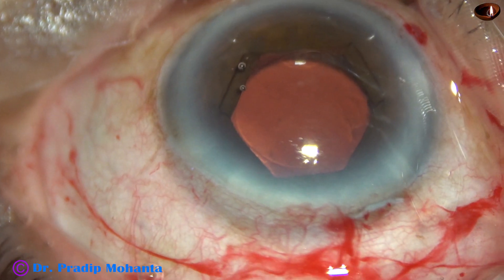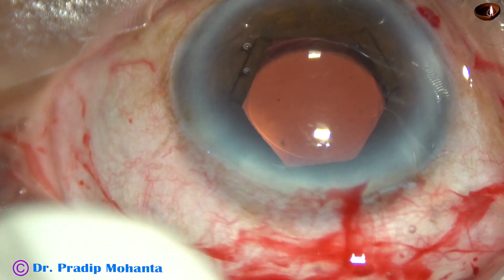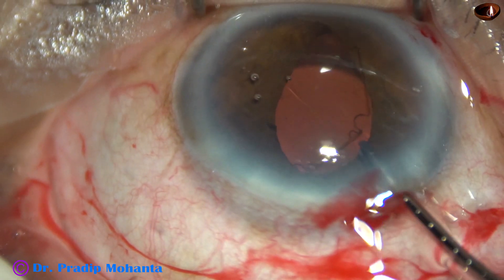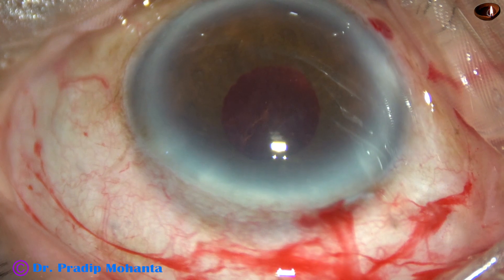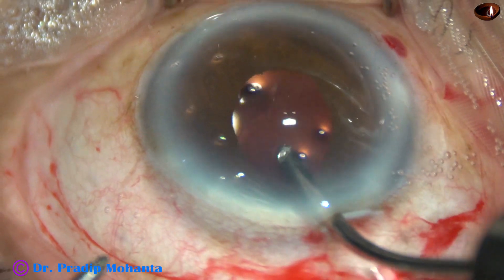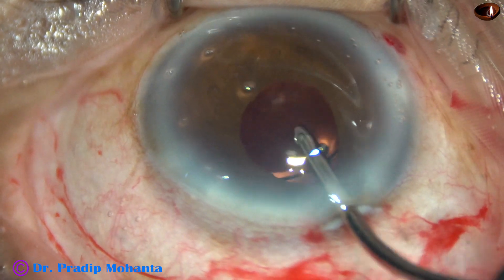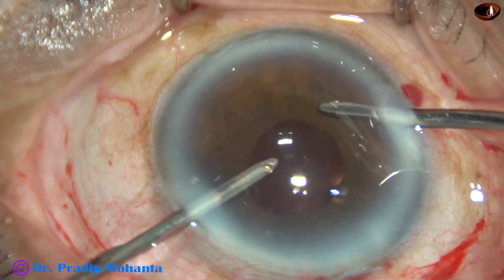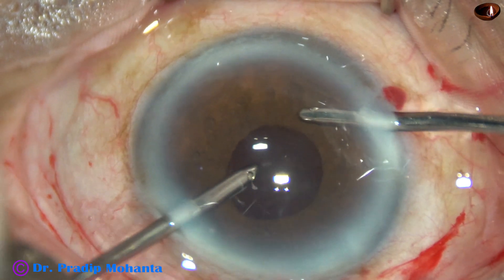I take the B-hex forceps, hold the flange at 4:30 o'clock, pull it centrally, go above the iris again towards the periphery. Pull it centrally, go above the iris towards the periphery, and all the flanges are untucked and it is removed. So application of B-hex is one minute, and its removal is about 30 seconds. If we invest this one and a half minutes, we can do this case very comfortably. Whenever the pupil becomes small at any stage of surgery, we can apply this device. And it is very much affordable to surgeons all over the world, not only in India — any developing country can afford this pupil expansion device.